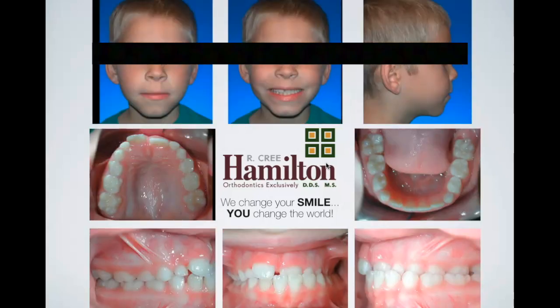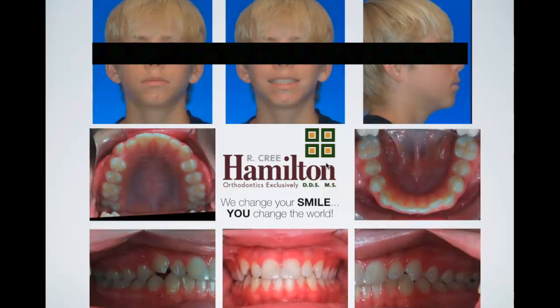Okay, going back to here and going to here. What are the arguments that we did get skeletal expansion? All right? What? Absolutely, right? When you look at these teeth, they are palatally, basically retroclined, right? Which from a skeletal standpoint is kind of good. That means the jaw's wider, right? So there's kind of arguments that maybe A, we did get a lot of skeletal expansion, or B, aesthetically, we could have gotten more. So without a 3D superimposition, you don't really know, right?